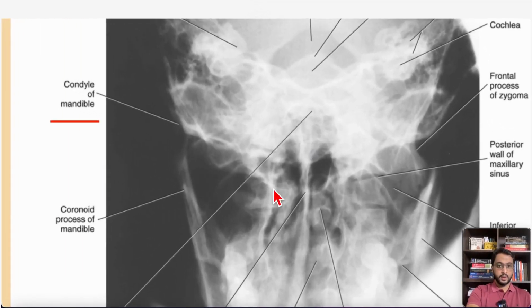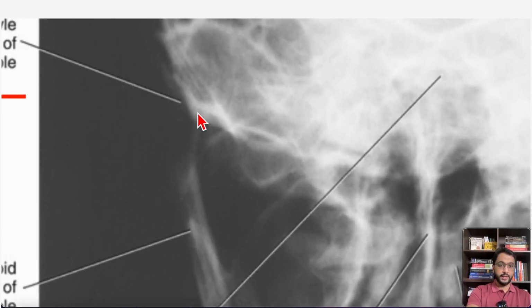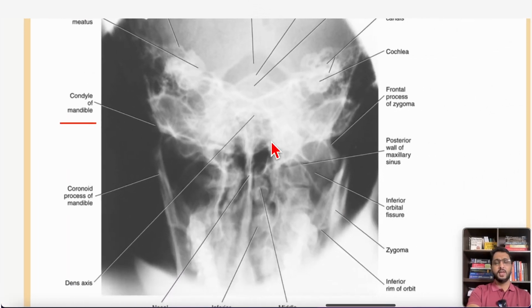Now, where is your condyle? This particular structure is what they're talking about. They're saying that that is the condyle. Okay, this is the condyle they're talking about there. Hopefully, this is a condyle, it's coming up there. So it's a condyle. Now all these are gone.